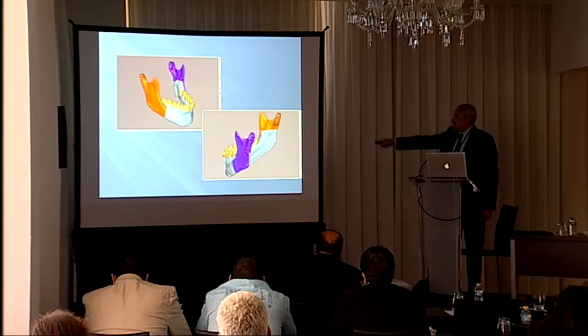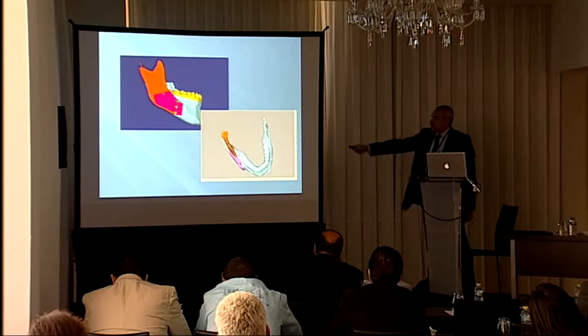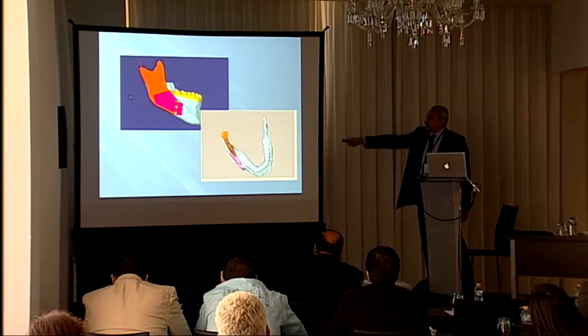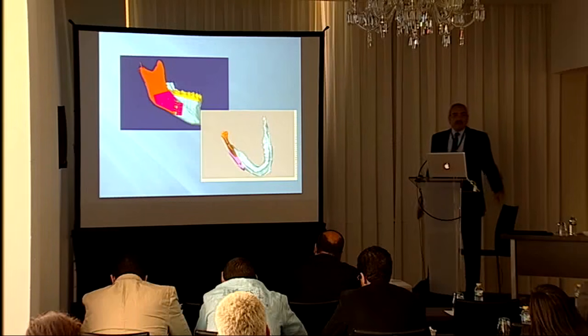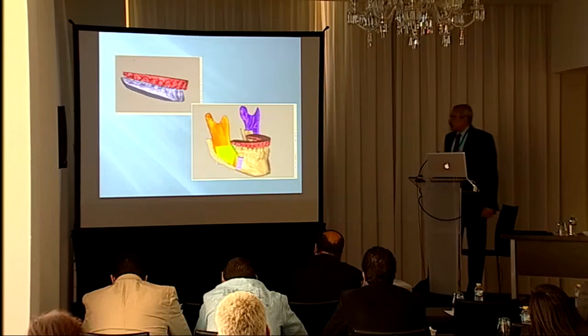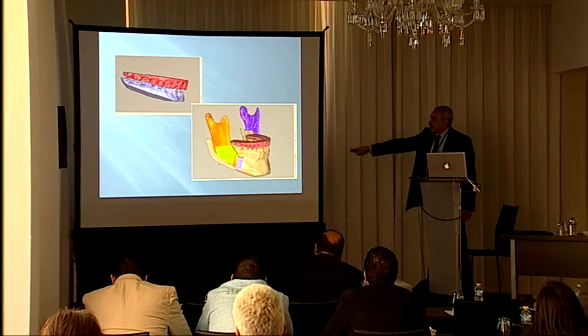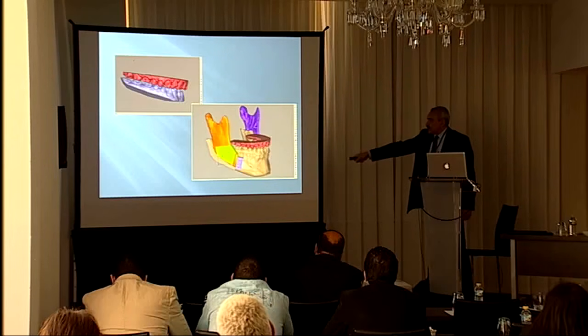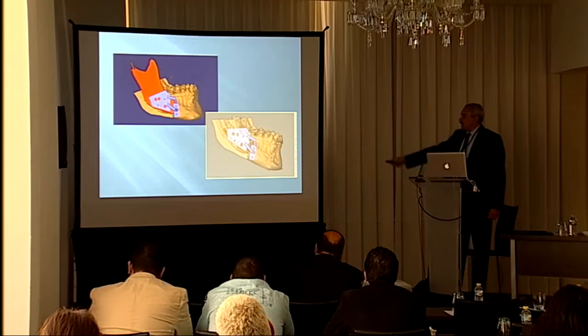Then we design the CT scan cuts, and we start now by doing the template that fits on what we call the proximal segment and fits on the distal segment with the use of these two rods. And we fix that preoperatively, then we take it out and fit another, identical one, with the difference being in the rod length and the rod direction for the postoperative phase. This is a demonstration of the models being moved according to the planned postoperative occlusion. Then the arms are now removed, and we recreate new models like that.